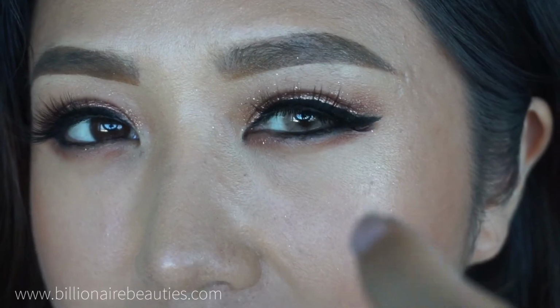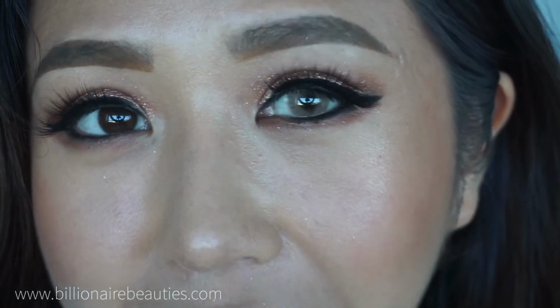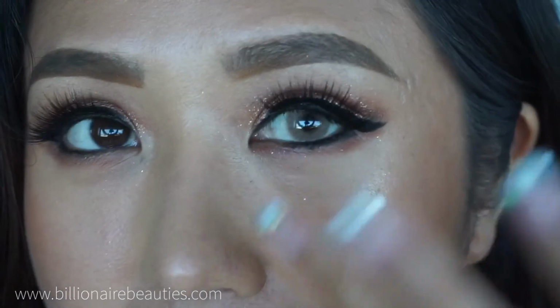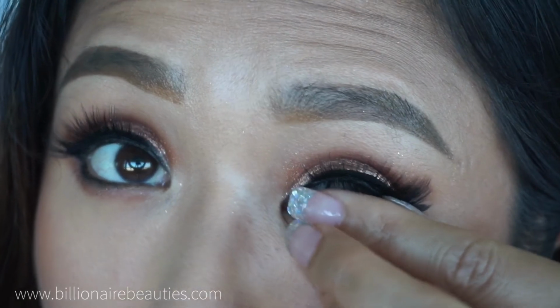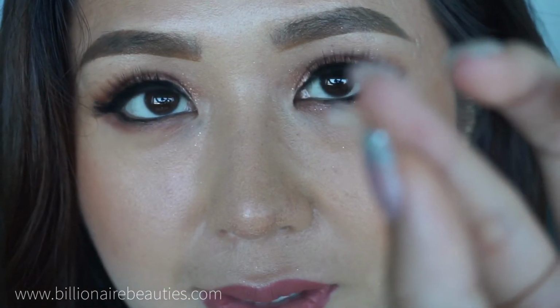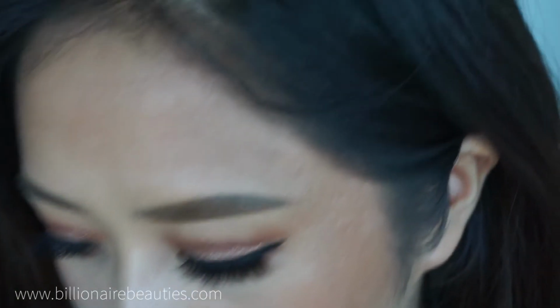I don't use my fingernails. I've seen people use their fingernails, and I'm like, oh god. I avoid that. You just go like this and kind of grab it like that. See that? So you use this bit of your finger and then grab it slightly, but you never pinch it because you don't want to ruin the contact lens.